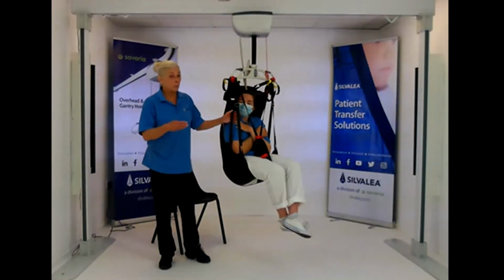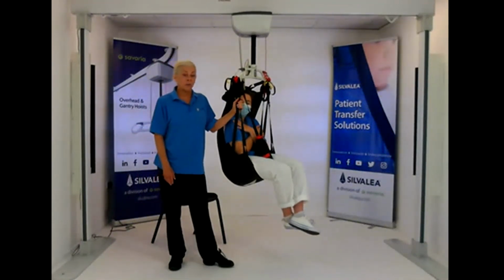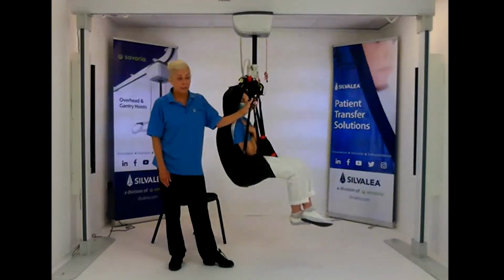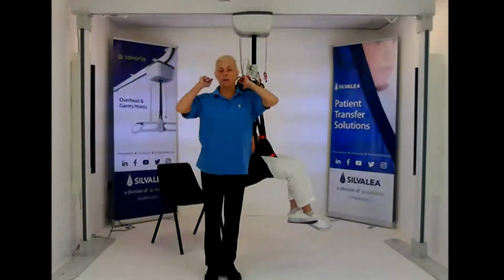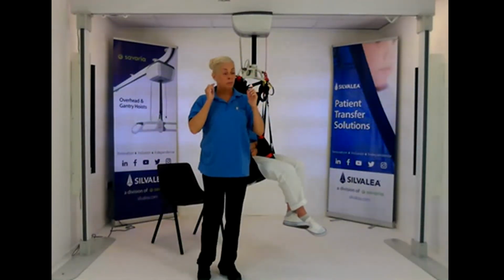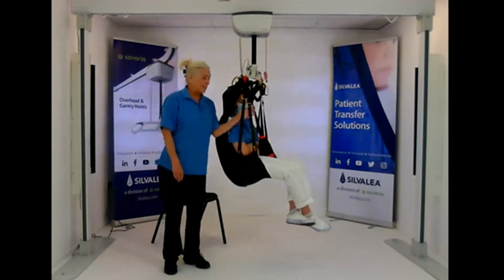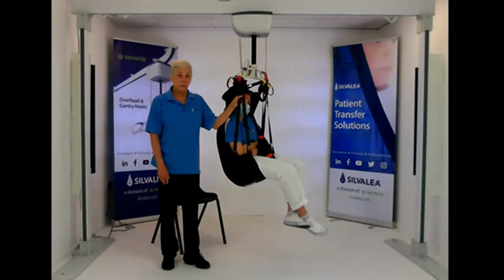Limitations of use. Again, one of our guests is saying that she's got someone that pulls right forward. As I said, if they are so strong and determined to do that, we may have a limit to its success. So, we had a situation in New Zealand a couple of years ago where they had to position the neck in a very accurate position. Otherwise, if they flopped forward, we'd cut off their airways. So adjusting it in that instance, this worked perfectly, and they'd exhausted all other styles. So it's a very individual style, an individual success style as well. So it's difficult to know.